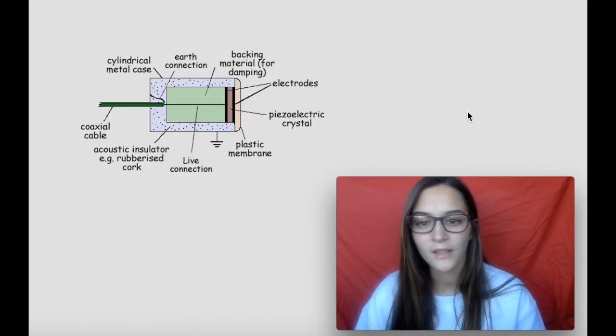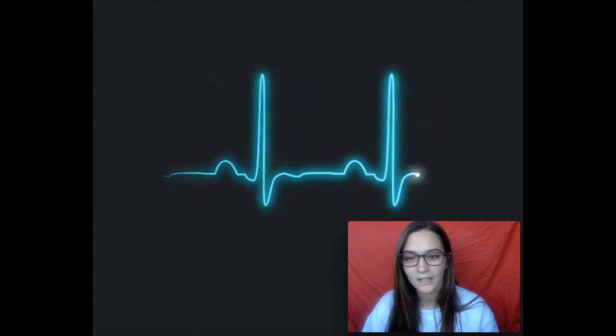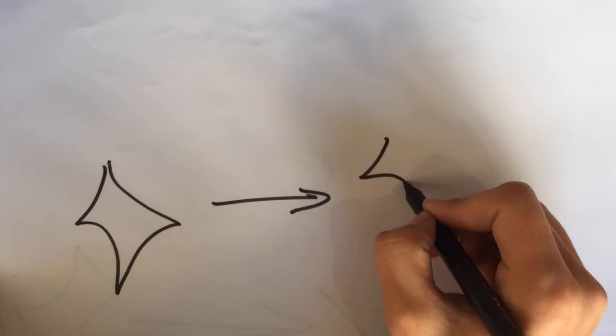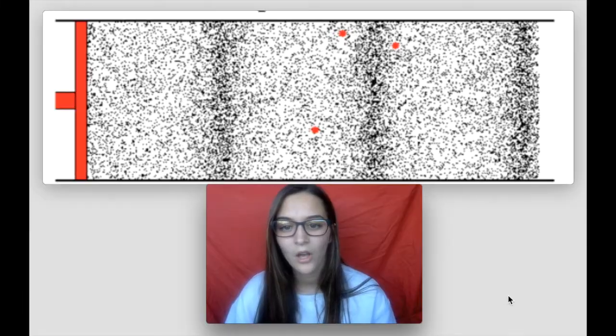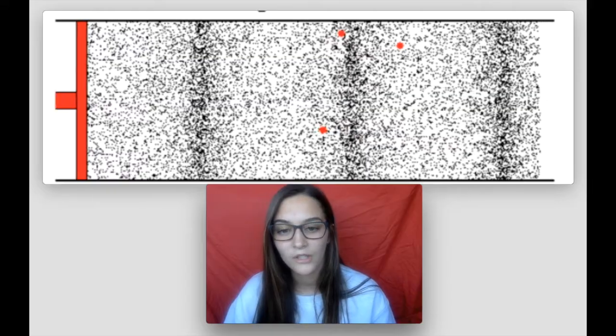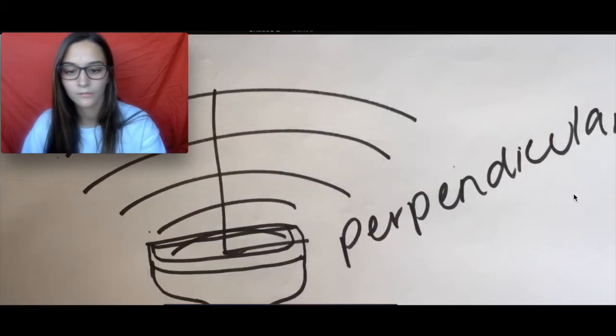The transducer receives alternating electrical currents and converts them into mechanical waves, generally at a high frequency of 1 to 5 MHz. It does this by reacting with the electrical pulses. The piezoelectric crystals change shape and size, and this causes them to rapidly vibrate, generating an array of mechanical waves that travel outward. A vibration source in a mechanical medium will result in longitudinal wave propagation, compressions, and rarefactions. It emits the converted sound waves from the face of the transducer, and the particles will move in the same direction as wave propagation. The ultrasound waves that are emitted will always be perpendicular to the transducer.